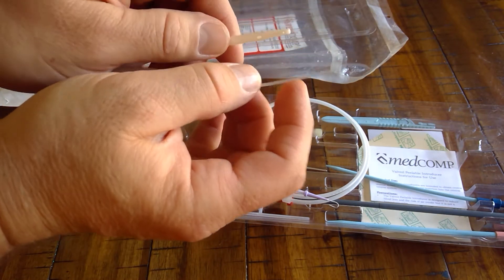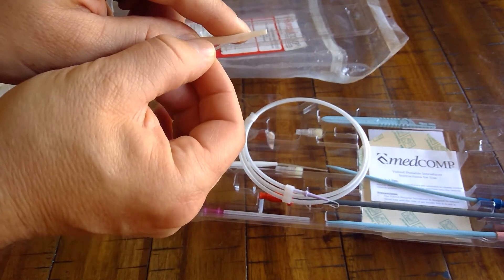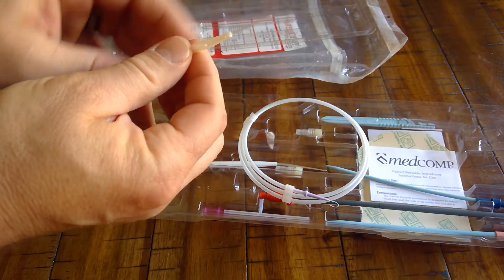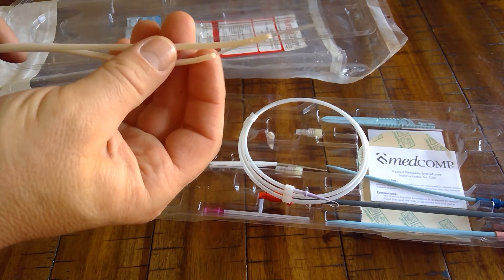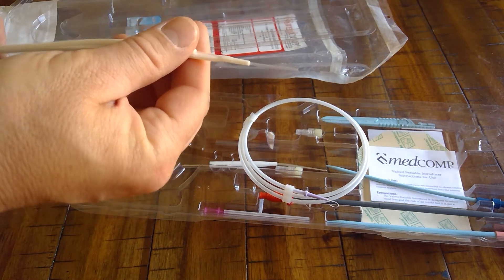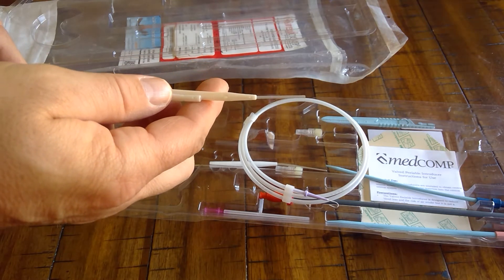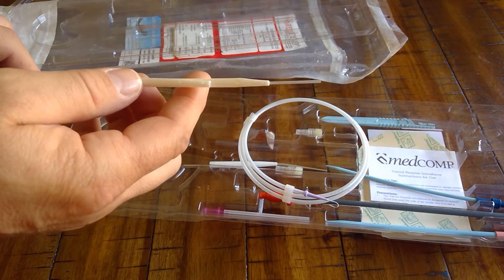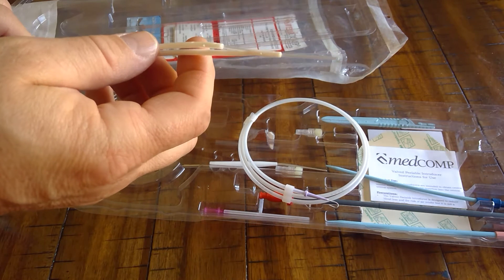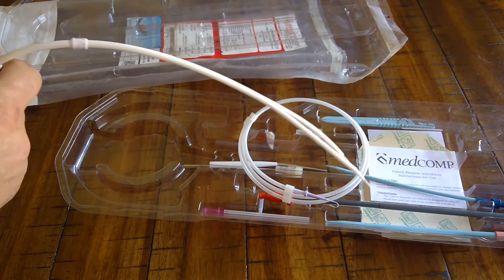Take the stylet and on the inside of the catheter you'll see a medial side hole. Slip the stylet through the side hole carefully so you don't kink it, then pull it out the distal tip. That puts both the proximal and distal lumens on the stylet. Your guide wire goes through the existing malfunctioning catheter; back out that catheter leaving the wire in the patient, then slide this over the wire through the tissue tract and venotomy site down into the right atrium. Remove the stylet and the catheter is in place.